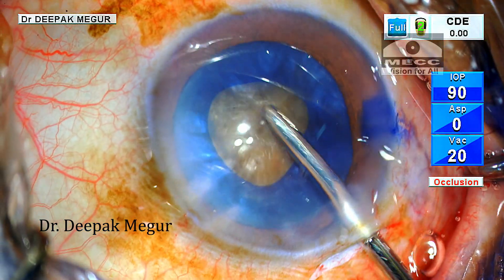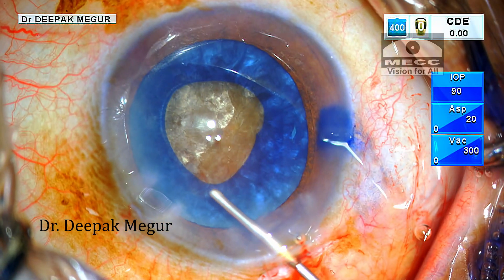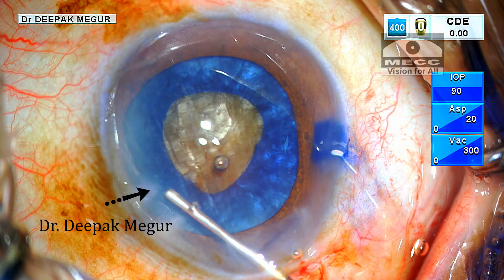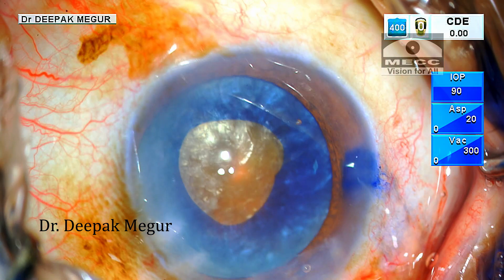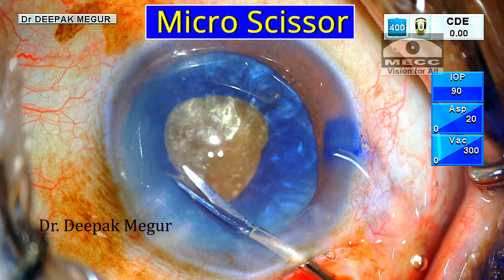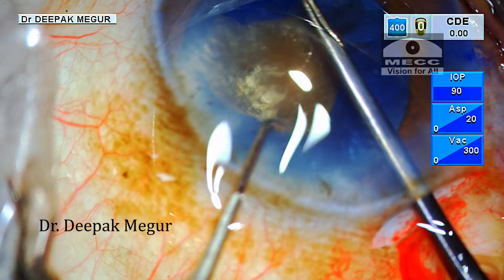Once all the swollen cortex both in front and behind the nucleus is flushed out, I am injecting viscoelastic into the anterior chamber, directing it away from the rhexis to prevent the OVD from getting into the bag, which might again increase the intracapsular pressure. Now using micro forceps, a tangential cut is given to the rhexis margin and a flap is raised, enlarging the rhexis in a very controlled manner.